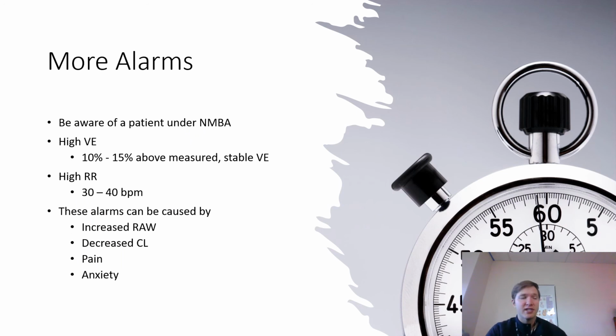All right, first line here, beware of patients under neuromuscular blockades. Neuromuscular blockades can be very, very serious, and we do like to use those. They help reduce CO2 production. So if we already have a patient that we're using permissive hypercapnia on, we're letting their CO2 levels climb on purpose, we're letting their pH stay at a survivable level, that's going to be important because that allows that ventilator not to destroy lung tissue. It allows the lungs to recover while still keeping the patient survivable.